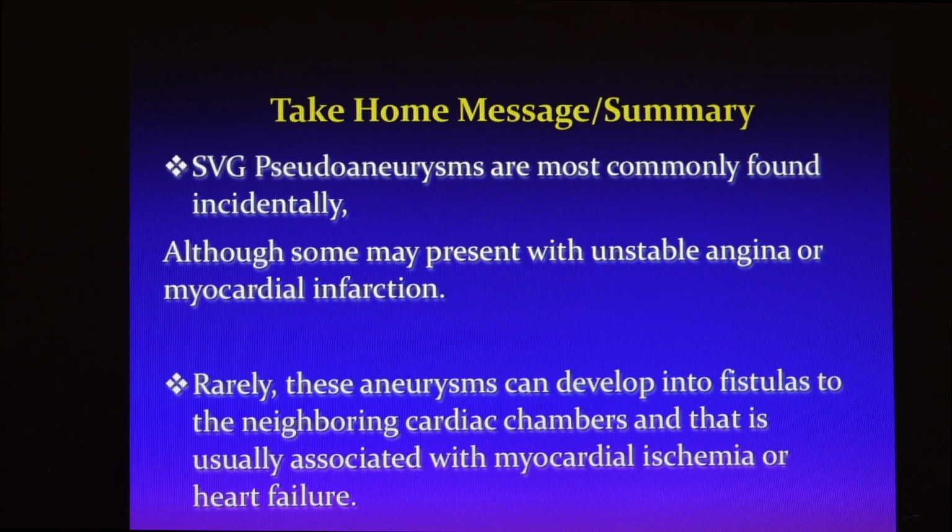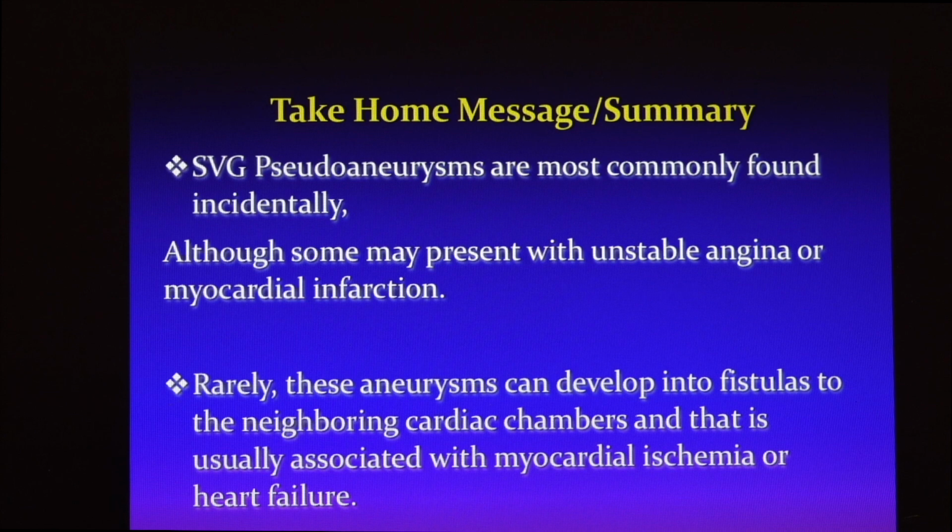So the take-home message from this case is you actually may see these pseudoaneurysms. And most of the time, they don't cause fistulas. You can either coil them or close them with a plug, depending on the area that's supplied by this aneurysm. But in some cases, it may cause a fistula, and you may need to achieve 2 things: maintain good blood flow distal to that aneurysm, while you are excluding the aneurysm to let the aneurysm thrombose. And we were able to do that with the Viabahn.